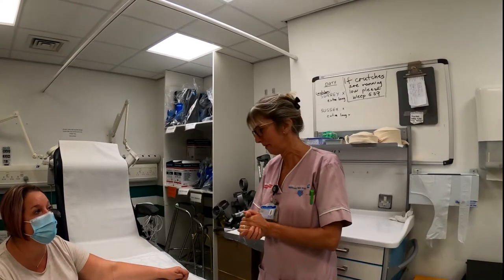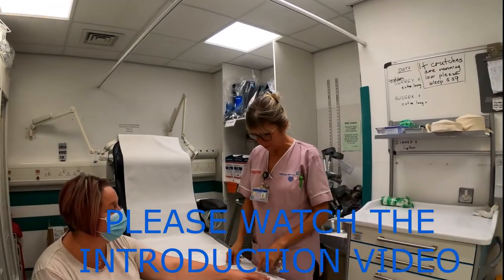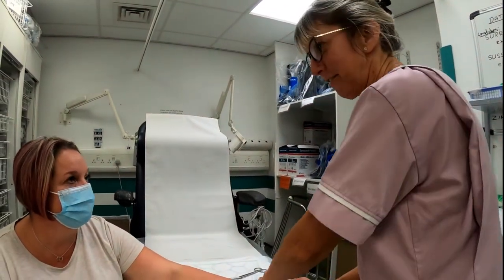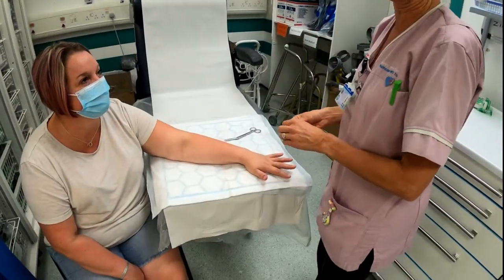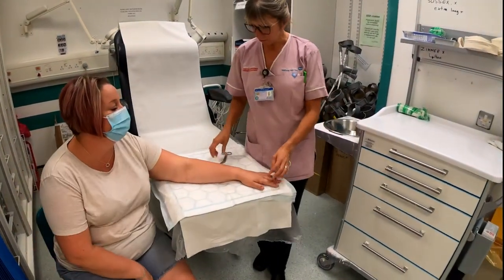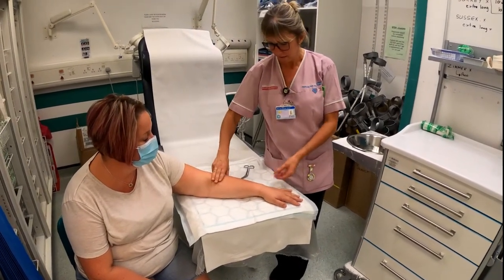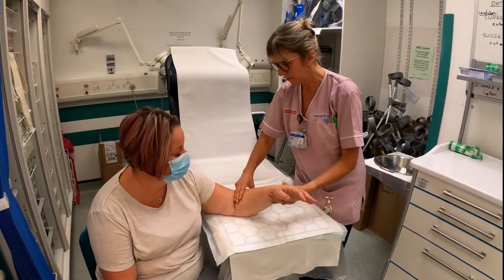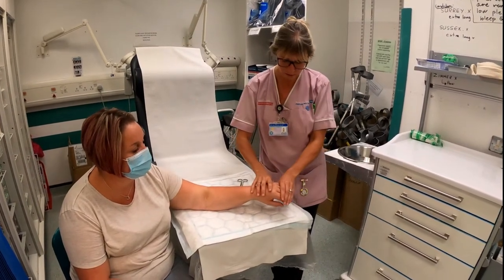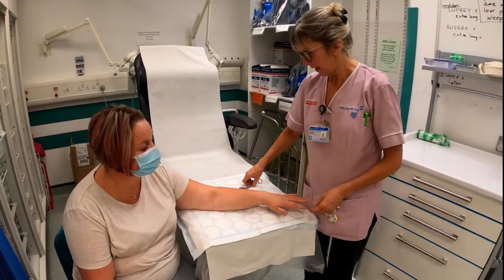This is the below elbow back slab that we're about to do. We just need to make sure we remove any jewelry and any ECG tabs that may be left on the limb. For the below elbow, we need two to three finger width space from the elbow crease so that when you put them in a sling it's not going to affect circulation, and the cast sits just below the knuckle line for free movement of all fingers.